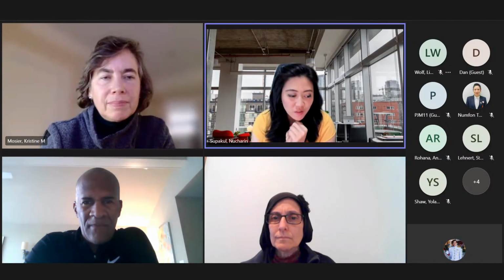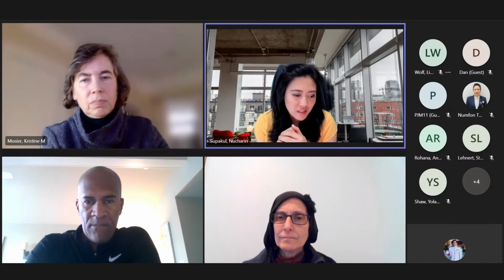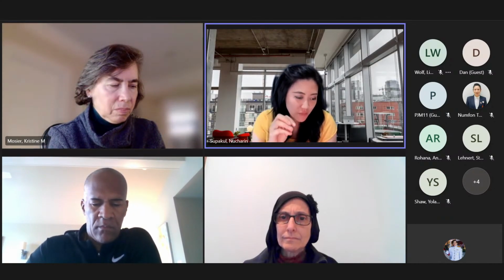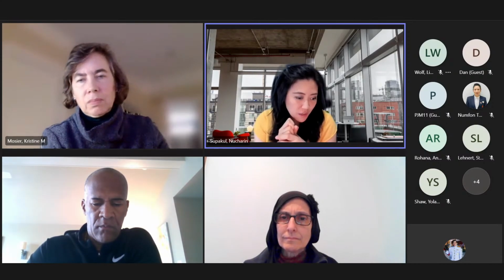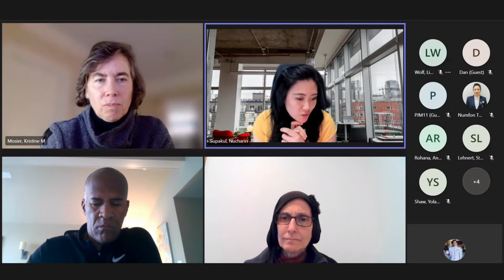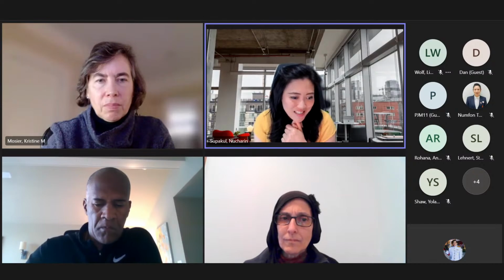You make it clear. So Dr. Ballinger, I have a question for you, because a majority of our patients are pediatric, and sometimes we need to do the study under sedation or GA. So there may be a limitation with open and closed mouth position, but we can give contrast for sure. Are you okay with just post-contrast images, if we cannot have an open and closed mouth position or dynamic study?